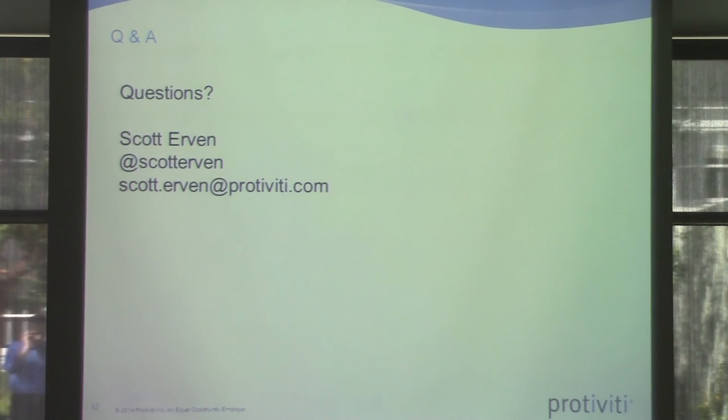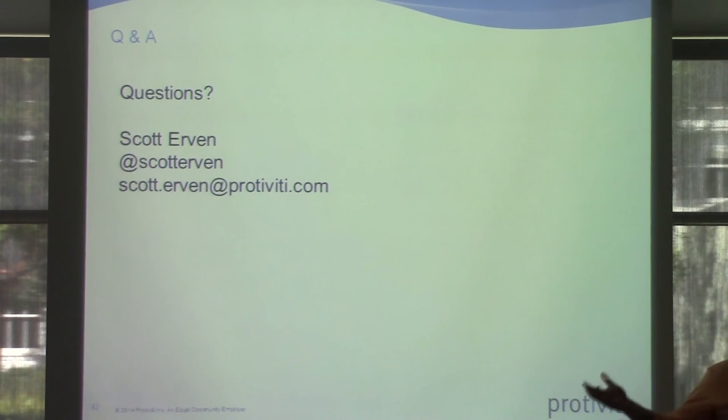So I can tell you, looking through documentation and from experience, those systems, those centralized monitors for infusion pumps, control the drug libraries, but there isn't whitelisting, there's no code signing or anything for those updates. There's not even network level controls that say this is a trusted source. So if you know how to forge the actual drug library, you can push it and it will accept it.